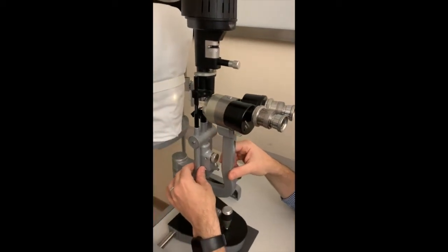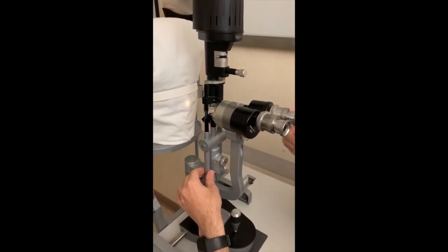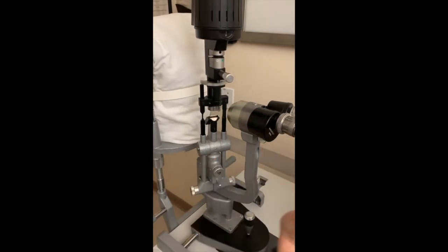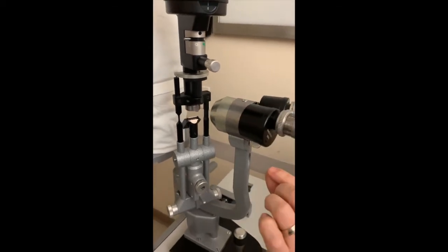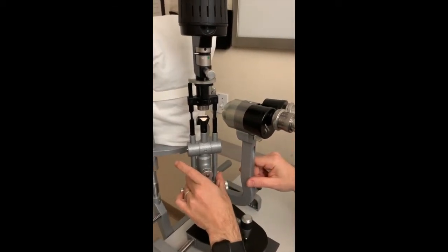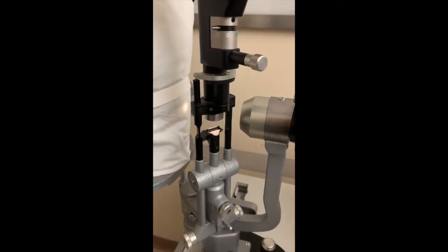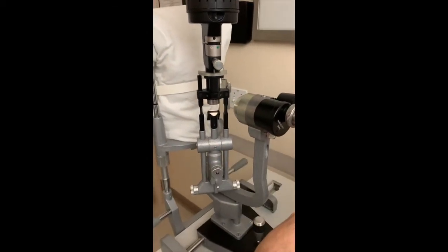But if you need to identify structures on the front and the back of the cornea, or within the anterior chamber, or on the front or the back of the lens, then you separate them, and the light goes at an angle. There's a refraction across those surfaces that gives you two images, one of the front of the surface and one of the back. If you're at an angle, you can look at the surface of the eye without blinding the patient because the light's coming in at an angle. It's useful for looking at the cornea, but it will also show you the front and back of the cornea, the depth of the anterior chamber, and the front and back of the lens.